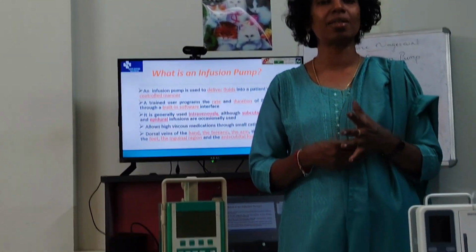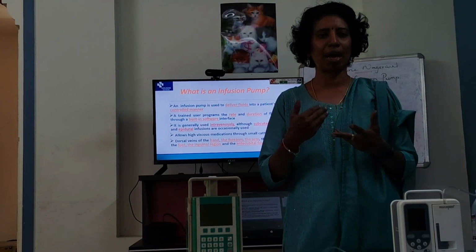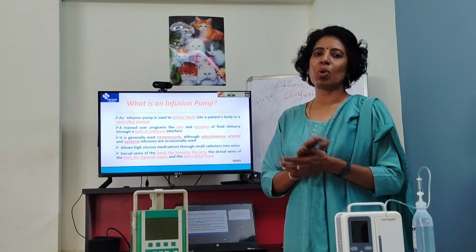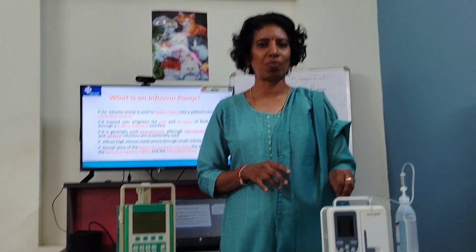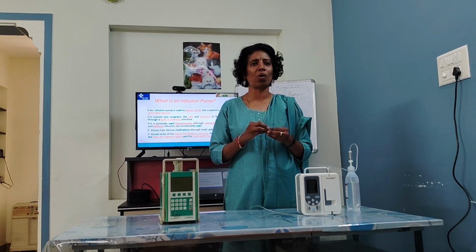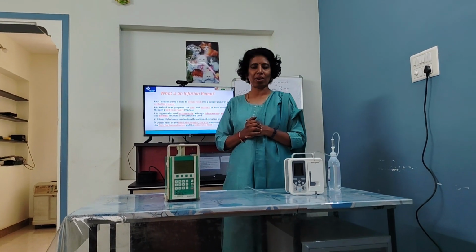An infusion pump can be used for administering fluids, food, liquid diet, or even medications. A trained user or programmer will set the rate and the duration of the flow of the medication to the patient. We have inbuilt software which helps in setting the correct rate and duration of the flow of the fluid to the patient. And it is generally given intravenously.